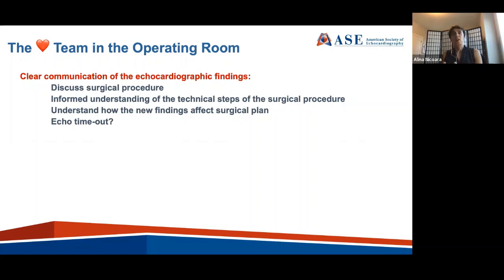I do understand that many of us work in a private practice environment where we may be the sole provider. I have heard others mention the rush to heparin pre-bypass. However, as we have undergone so many cultural changes, maybe we require one more cultural change. Do we really provide a good service to the patient by rushing pre-bypass to go on pump, or should we indeed take our time to perform as comprehensive an exam as possible? Do we actually need an echo timeout, for example, where we provide the surgeon a full interpretation of our findings?